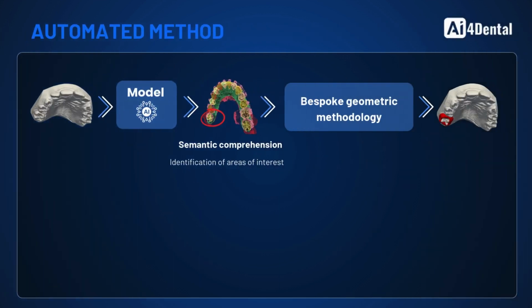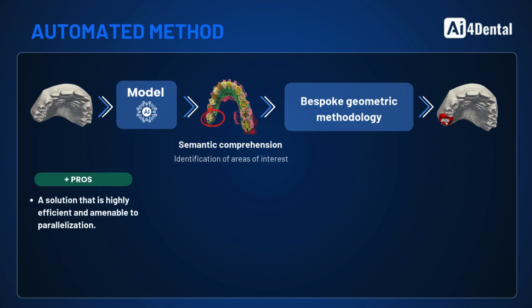What are the benefits of this technology? For laboratories, it offers a rapid solution to model creation, with the major advantage of being parallelizable. Whether processing one model, 10, or 1,000, it takes the same amount of time as tasks run concurrently. This significantly frees up time.